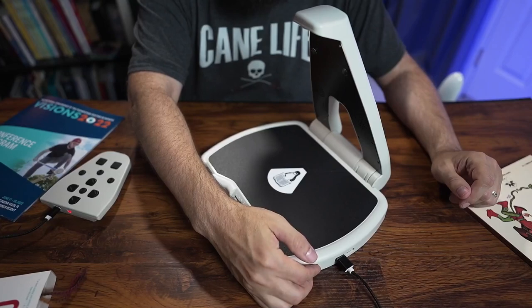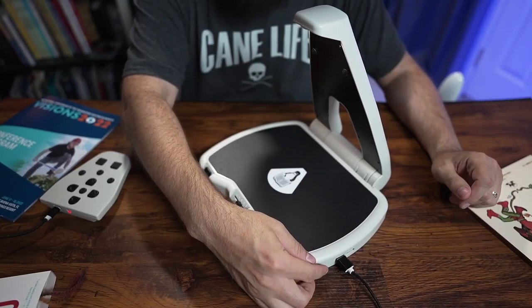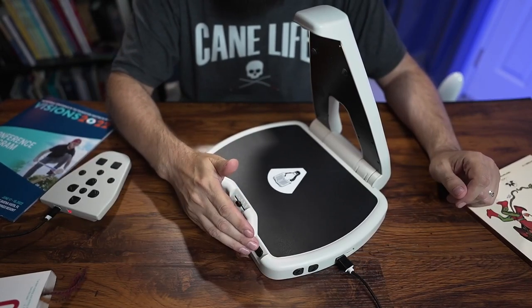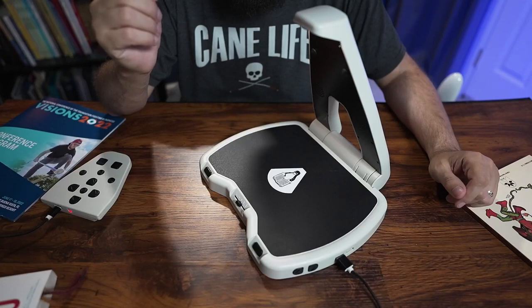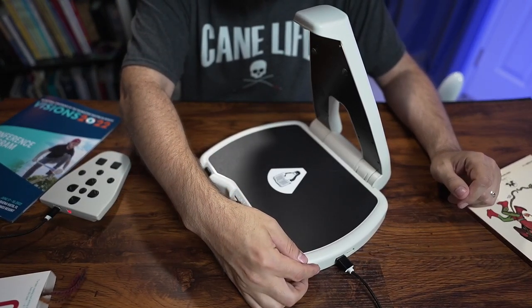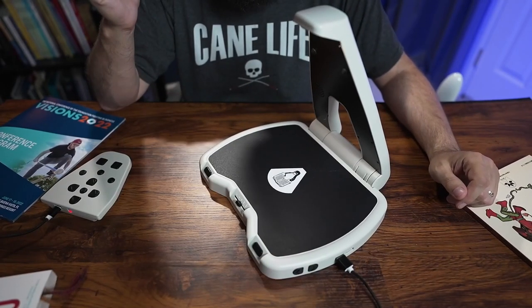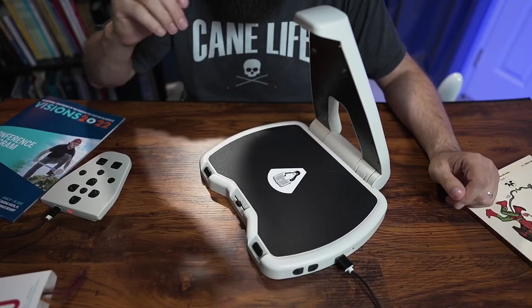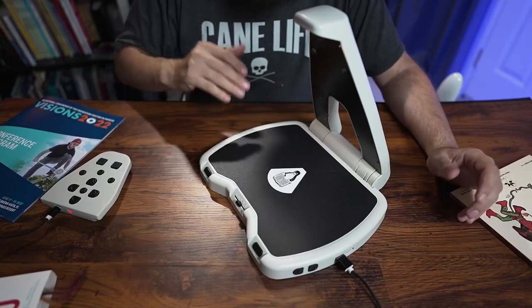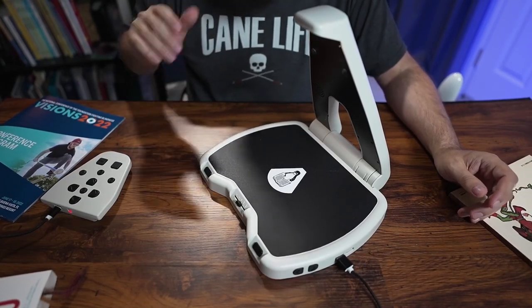On the side we have buttons to speed up the speech — I press it a few times and the speech speed increases. Now if I press play it reads faster: "San Diego, but we have endured a lot, and now it is time to come together to learn, grow, and celebrate." I can also decrease the speech speed back to normal. It's just so convenient — you put the document under there, it takes the picture and starts reading, and it's really fast and accurate.